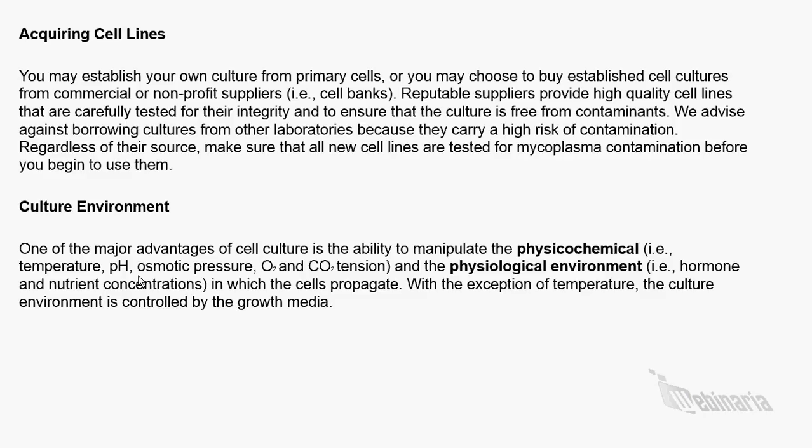Generally, it is advisable against borrowing culture from other laboratories because they carry a high risk of contamination. Regardless of their source, make sure that all new cell lines are tested for mycoplasma contamination before you begin to use them.